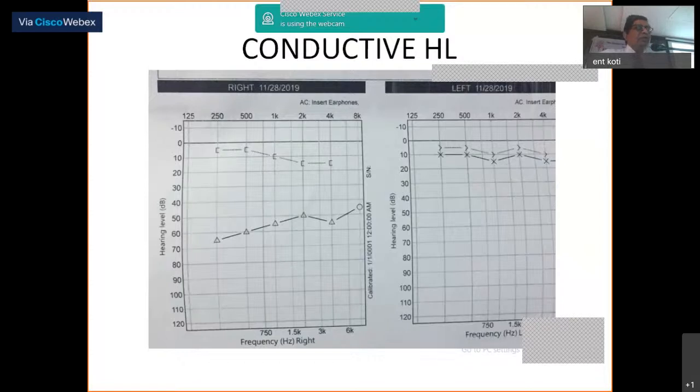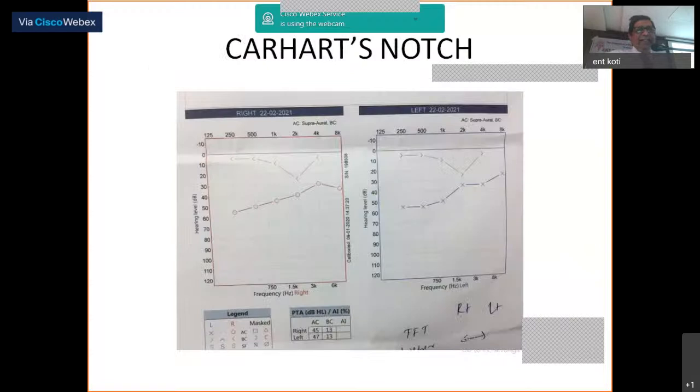So you got this, it is called an air-bone gap. So what is the air-bone gap? It is a conductive loss, and after we do proper surgery, the air-bone gap should close, or may not close. Okay? What are the conditions in which it occurs? Continue to read. Then there is an interesting condition in which you get this type of recording.